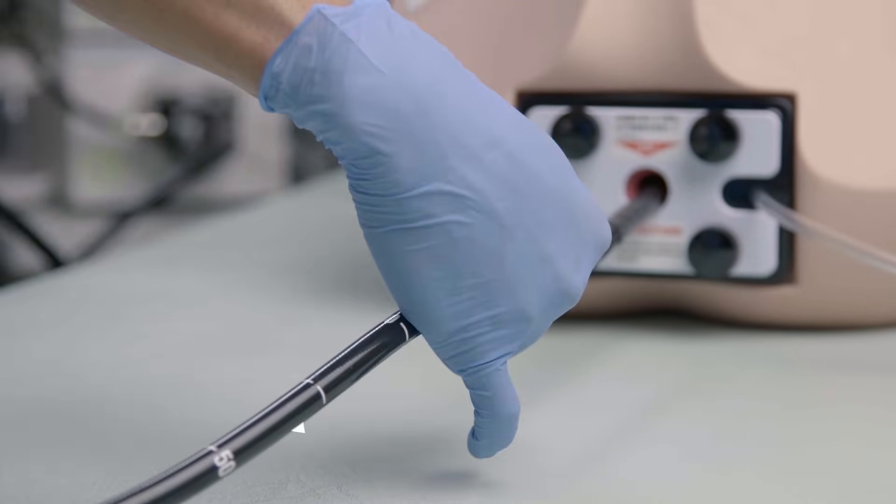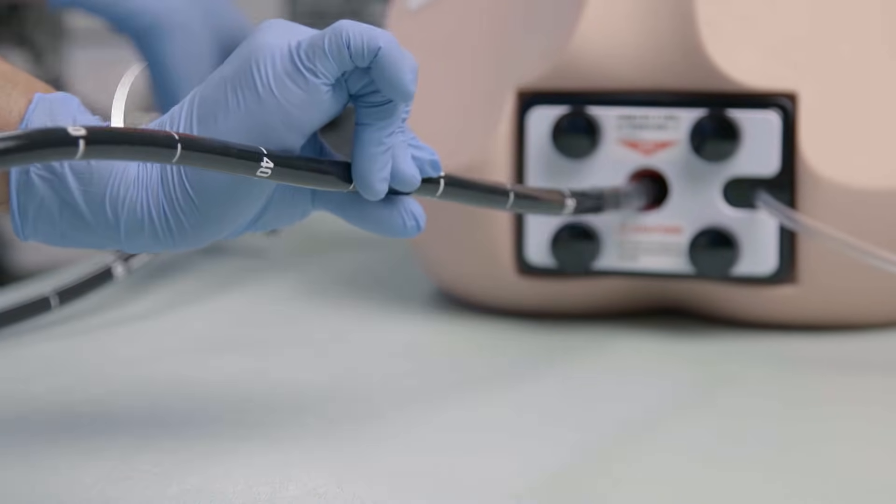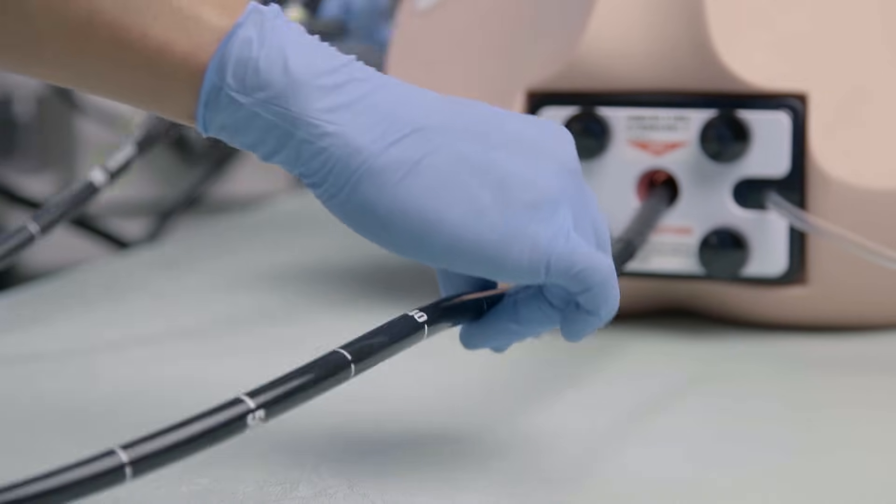By twisting and torquing the insertion tube to the right and left with your fingers, you can also achieve similar movements.